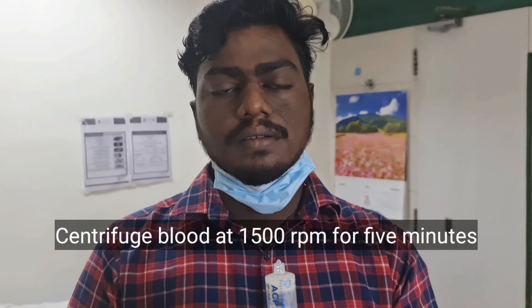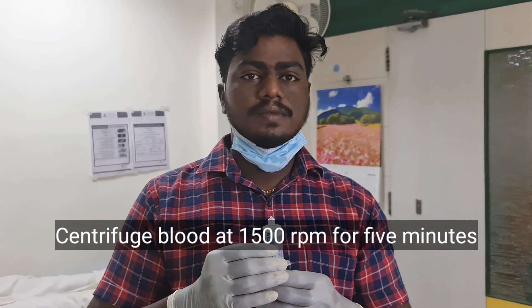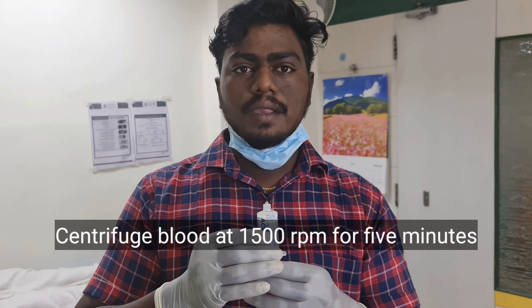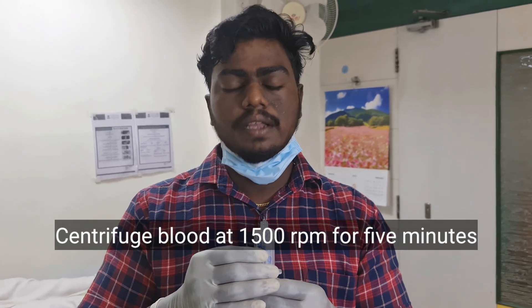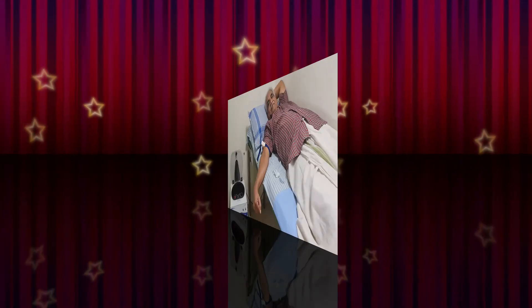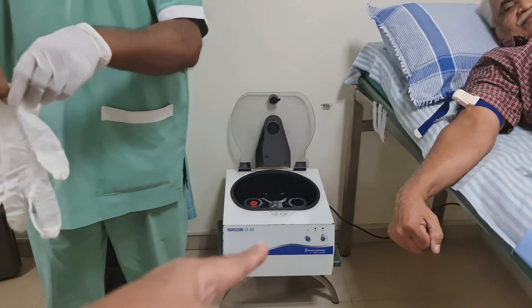Now we are going to centrifuge the blood drawn for 5 minutes. At what revolutions? 1500 RPM, sir. Around 1500 revolutions per minute. Yes, sir. And then we will get platelet-rich plasma. Now you can see the centrifuge there.